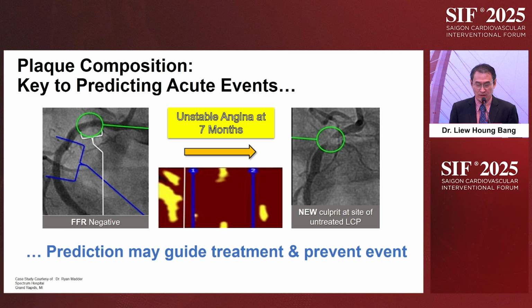When we do an angiography, when we have a near normal coronary, a patient who came to us with some chest pain, how do we know whether this is actually a high-risk lesion or whether this patient has microvascular disease? This patient, for instance, came back 7 months later and showed a progression of a stenosis. When we go back and look at the LRP, it was obvious. There was this yellow blotch on the chemogram. So it was able to predict.